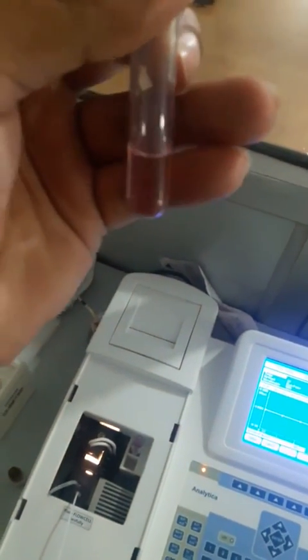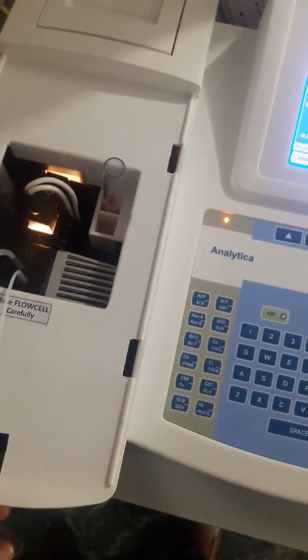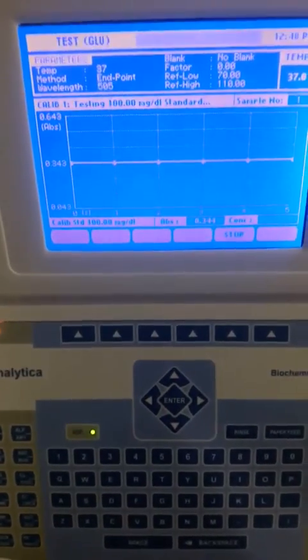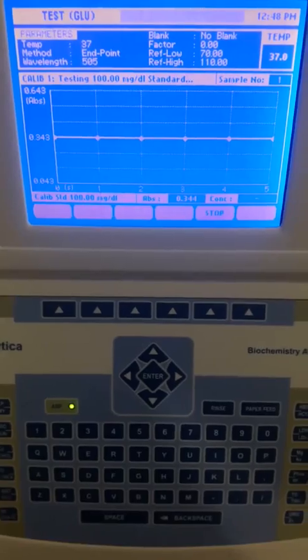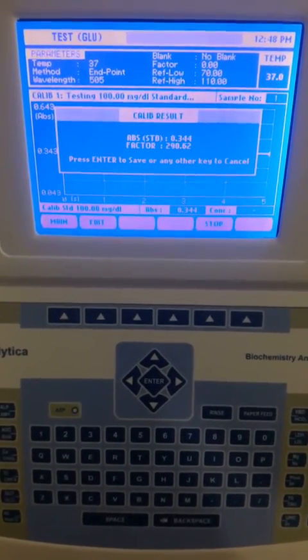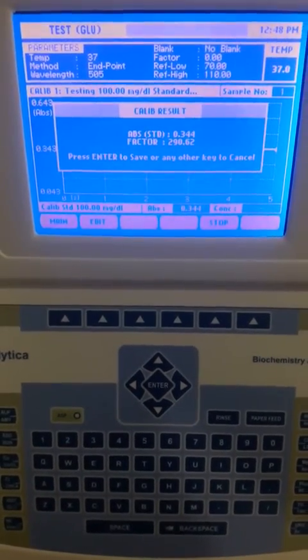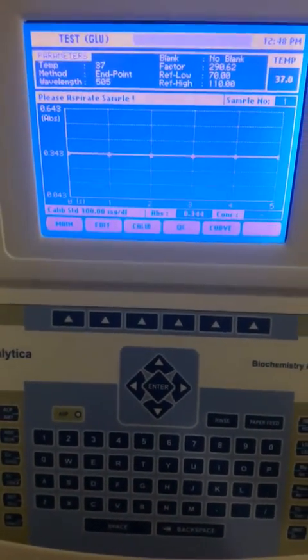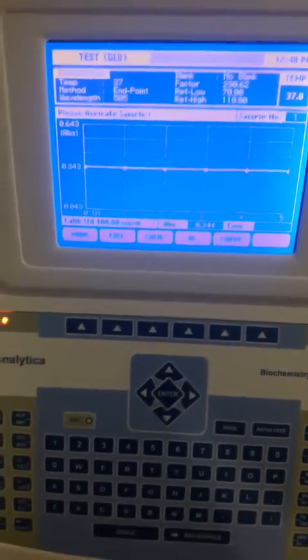After incubation is complete, you can see it is showing a pinkish color. Now we are going to aspirate this standard. The machine is calculating the value of the standard and will now show the factor. The factor is 290. We can save this factor by pressing Enter. The factor has been saved and now we can aspirate the sample.